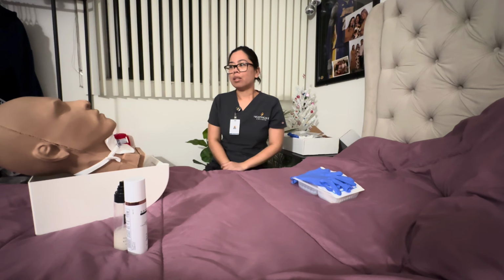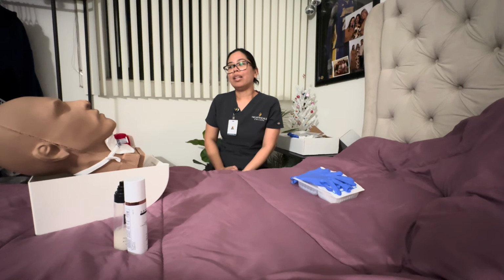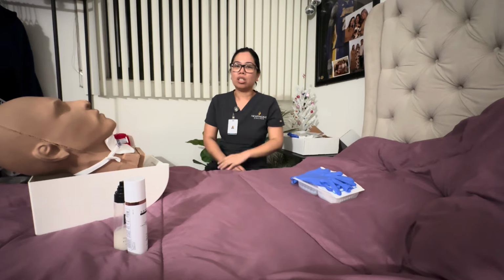Okay, so the most important thing is to have that assessment done, and to listen for secretions in the lung assessment. If the patient is having secretions, you want to suction before we do the tracheostomy care. So suction if needed for the patient.